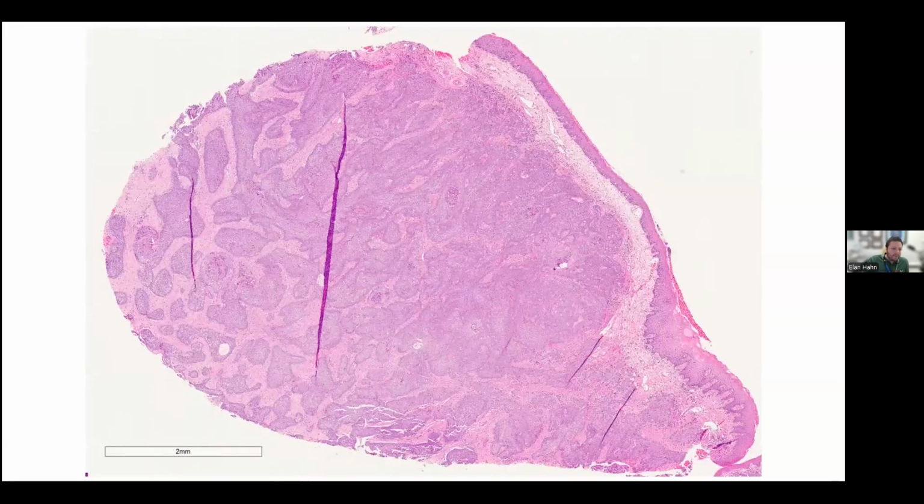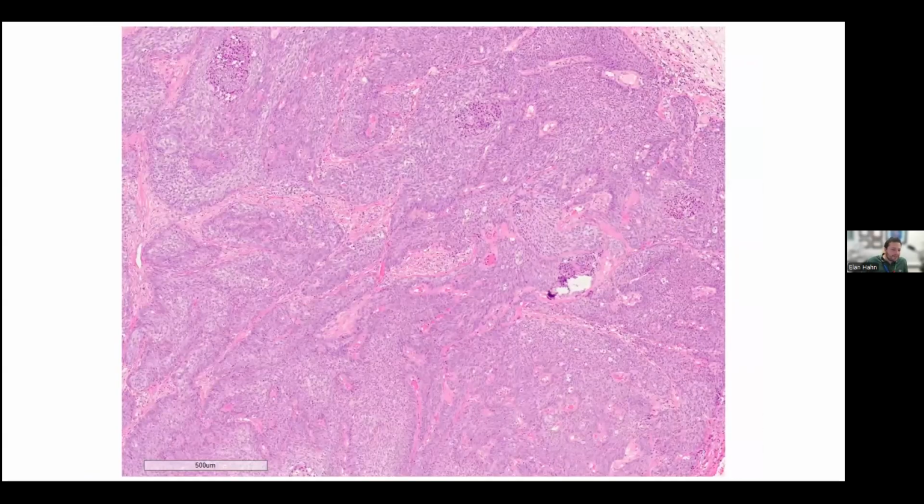Here again, we have one fragment that we'll be focusing on. Again, it's the sort of anastomosing nests or single irregular nests of cells. There appear to be some comedotype necrosis and maybe some glandular spaces towards the bottom of the tissue fragment. We get a little closer, we could see these appear very squamoid. There are some clear areas as well, and definite comedotype necrosis.